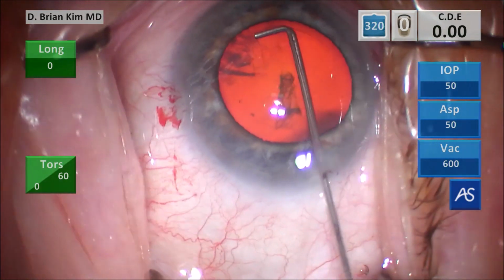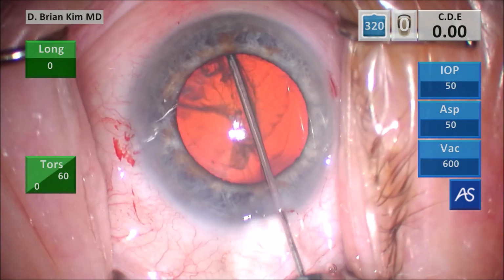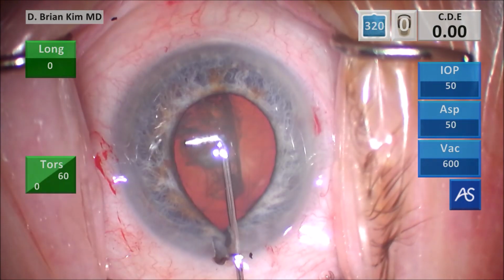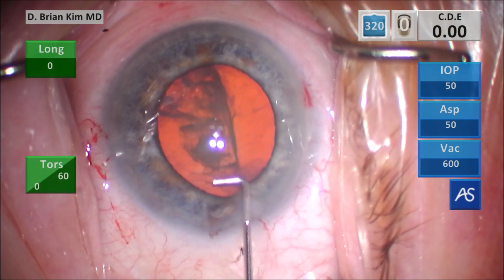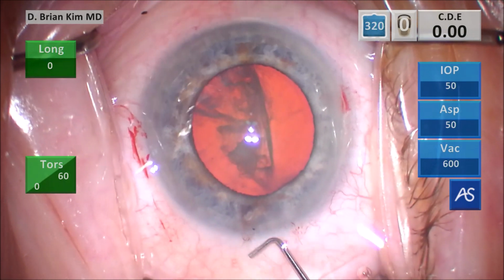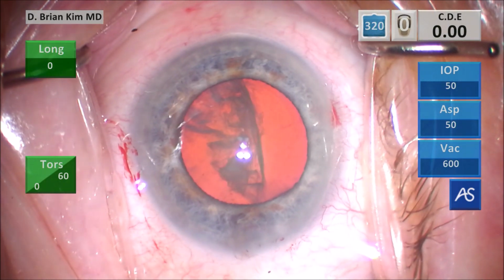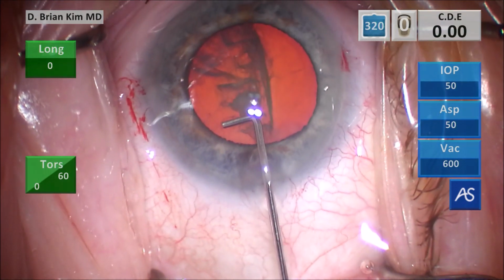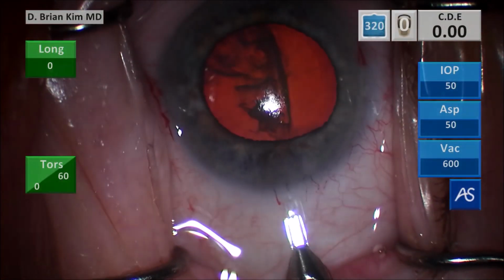I want you to pay attention. I'm going to make a nice slow wave here. Look how slow it is. It's a slow wave, and then look, the iris pops right out. And so clearly there was some pressure differential, and it caused the iris to come out. So I push down on the posterior edge of the incision, and the iris pops back in. So whenever you have iris prolapse, the key is to equalize the pressure inside and out of the eye. And so the only way to do that is just to push down on the incision, and it decompresses the eye, and then the iris goes back in.